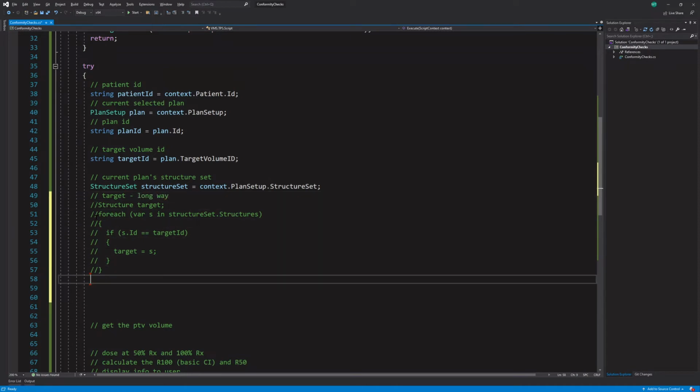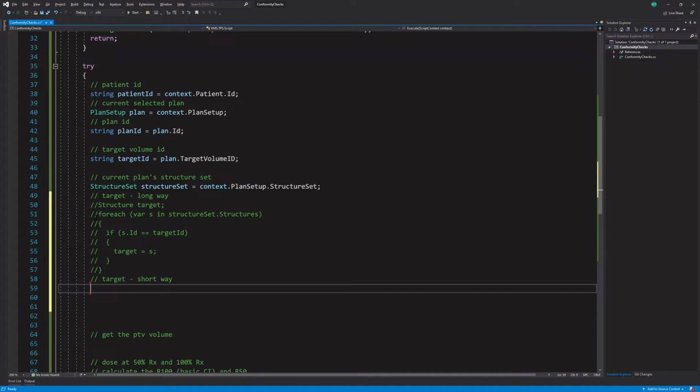Okay, and we'll say target short way. And we'll say Structure target equals structureSet.Structures.Where. Actually, you know what we could do, we don't even need to do a Where, so we're going to select the first structure, FirstOrDefault structure where. And so this is LINQ.